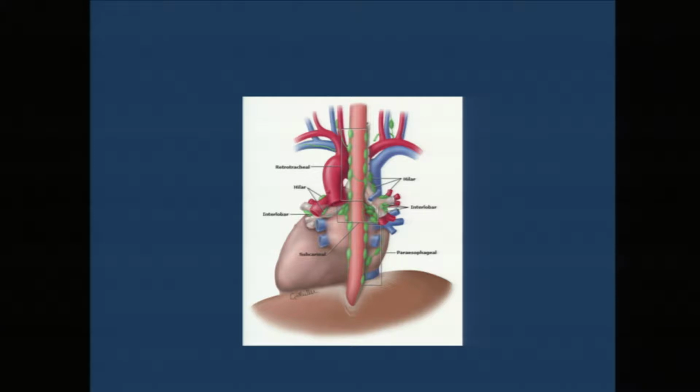The esophagus is right here, that pink thing going here, and this is the view from the back, from the esophagus looking in the front. That's your heart. And you can see the proximity of the basal cardiac structures to the esophagus very well, including the aorta. And therefore, this makes the esophagus a very ideally placed organ to put your probe down and to take images of the heart. You get excellent resolution. We can use high-frequency transducers.